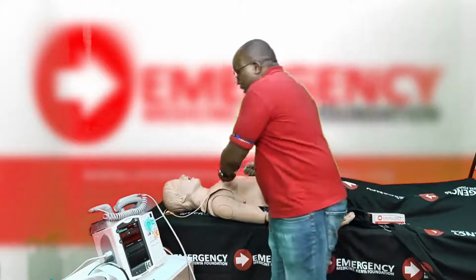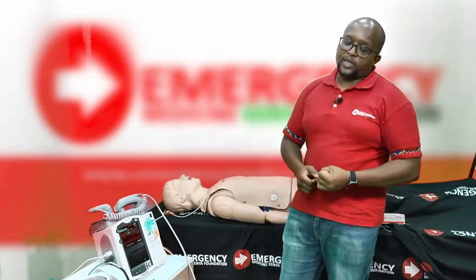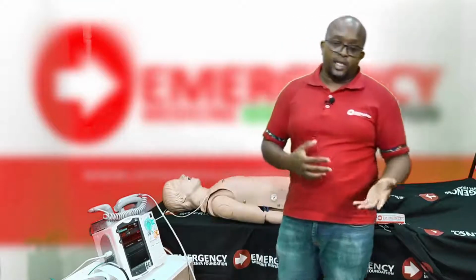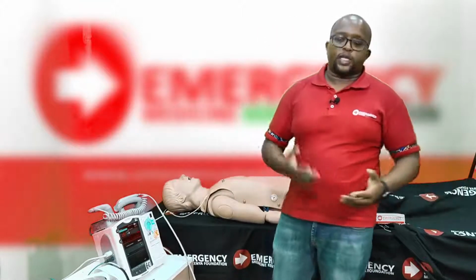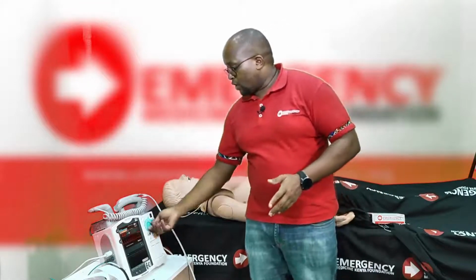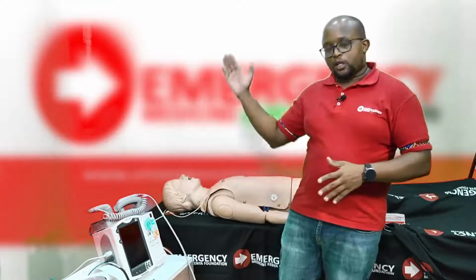Am I having good technique, okay? Am I making sure I'm applying enough pressure? Am I having good contact with the skin? And the third part of it is, have I considered other causes like hyperkalemia or toxins that the patient could have in the bloodstream that's causing the cardiac arrhythmia? Okay, if it's toxins, then no amount of shock will convert this. You need to consider the antidotes and potentially then use chemical cardioversion, because that's your other option. When everything fails, then you need to switch to what we call chemical cardioversion, okay, where then we will use drugs to slow down the heart rate.